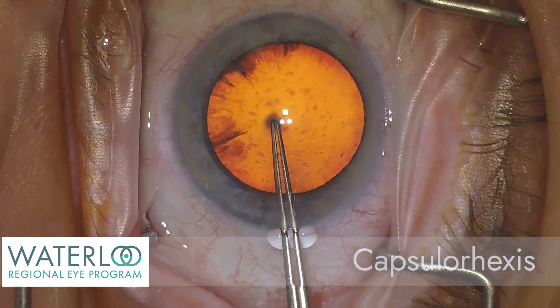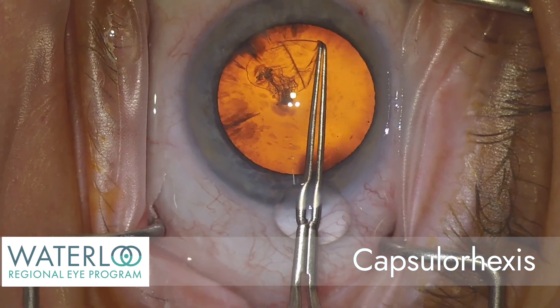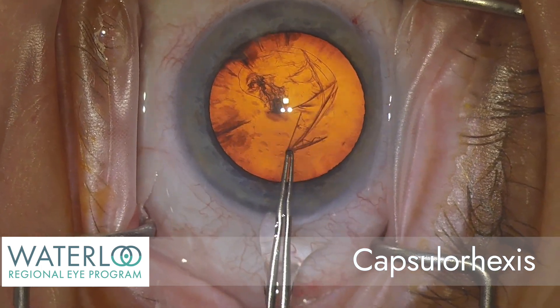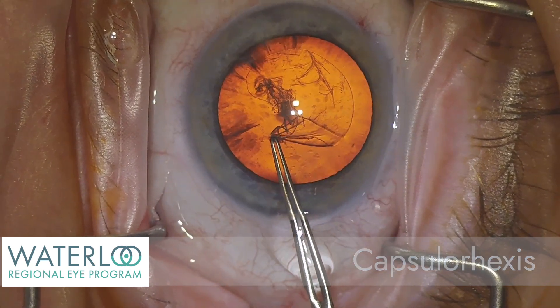A capsulorhexis is a circular opening in the front of the capsule that allows the surgeon to access the cataract without disrupting the support system, into which an artificial implant will eventually be inserted.